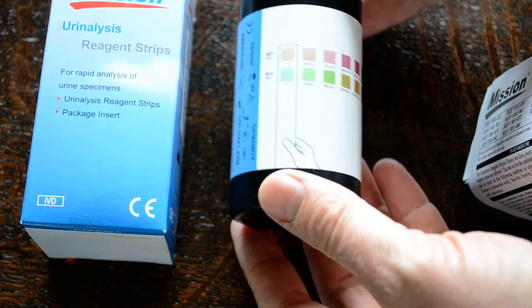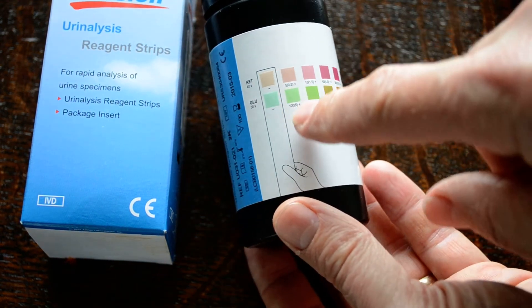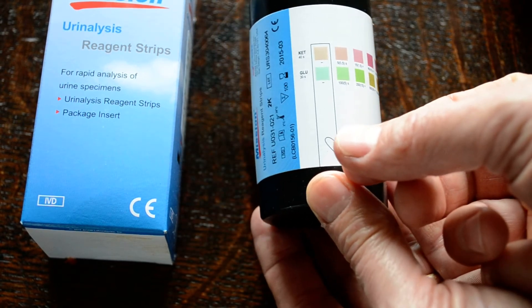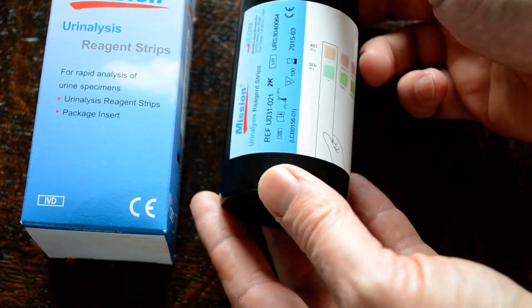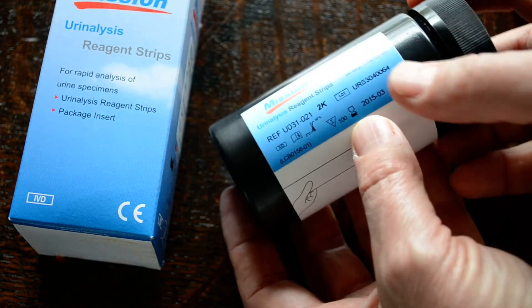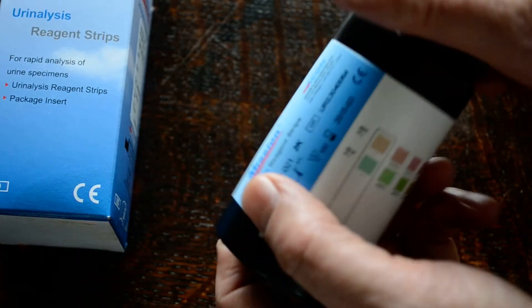If we show you these packs now, you'll see the indicative color pads. The handle end — that's the orientation of the test strips and how they're held when you come to interpret the results. The expiry date will be on the pack, along with the batch number and the manufacturer's reference.